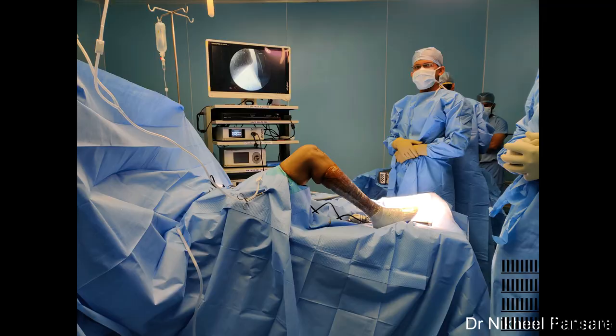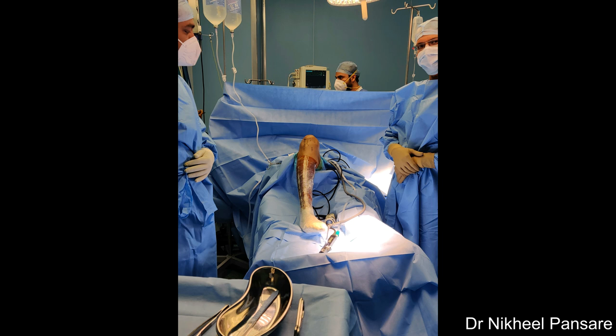We prefer on-table limb position supported by 90-degree post and a side post, but many surgeons prefer hanging limb position supported by thigh clamp. During initial few cases it is better if you skin-mark all important landmarks such as patella, patella tendon, tibial tuberosity, joint line, PES attachment, and standard arthroscopy portals before starting surgery for better orientation during surgery.